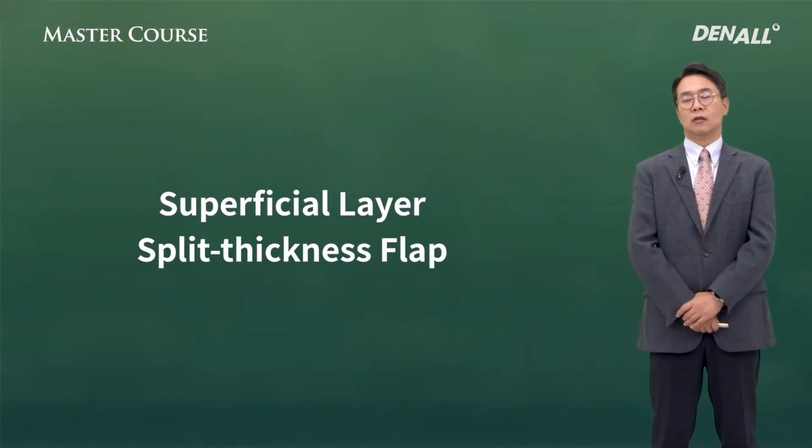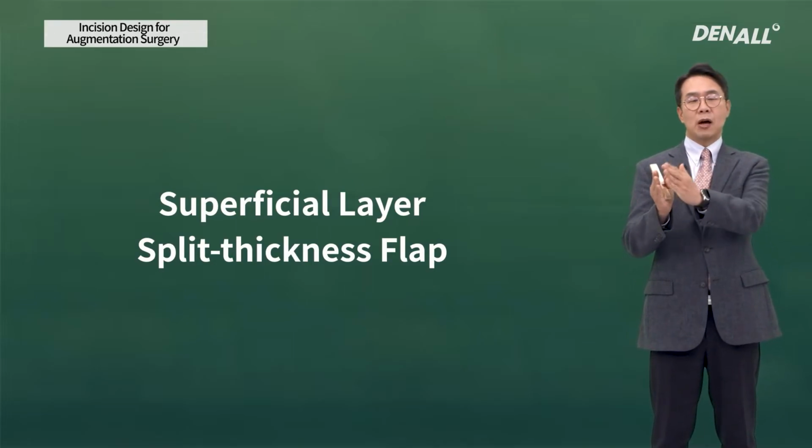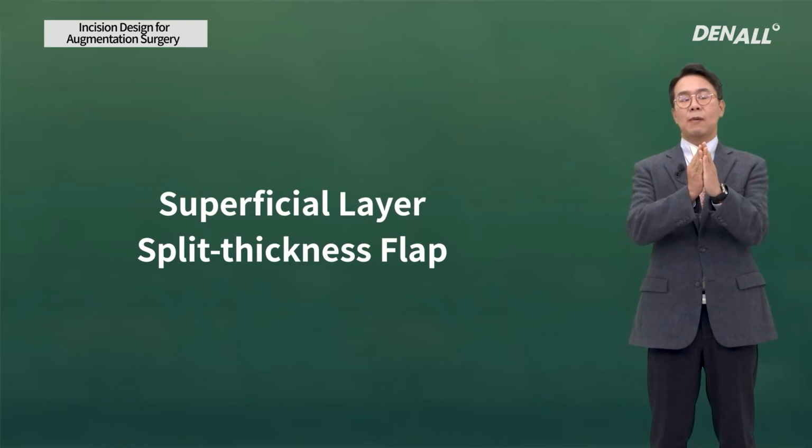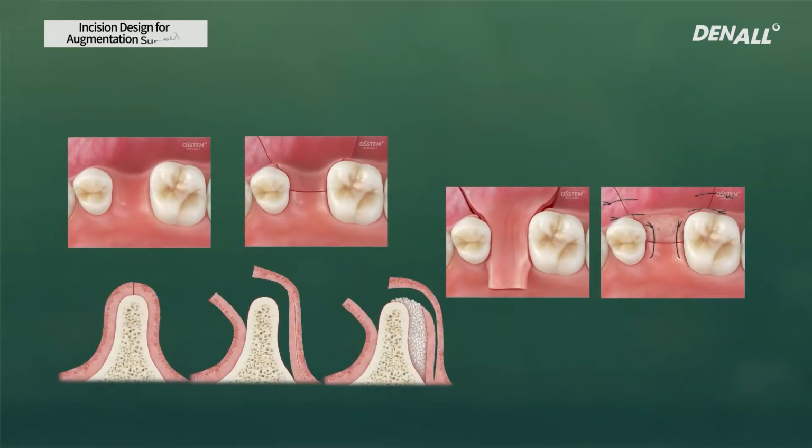Lastly, double flap incision. One flap is formed, but another flap is formed in the flap. So as you can see here in the maxilla, in this case, a little bit different, but depending on where muscle tissues are attached, and the muscle and inside of a flap is dissected, not the muscles, but outside of flap can be extended with this incision.